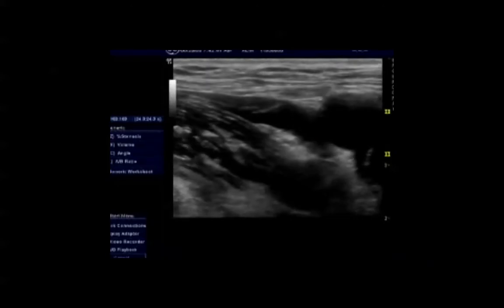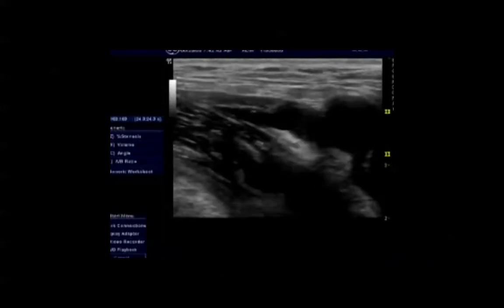But the important thing to note here is that at the end of our injection, here's our femoral nerve, which is still attached to the iliopsoas muscle. But our local anesthetic has passed in a tissue plane that is deep to the femoral vessels. So you can see the outlines of the fascia iliaca here illustrated by the green arrows. The local anesthetic has passed over the iliopsoas muscle, over the femoral nerve, or superficial to the femoral nerve, but deep to the femoral vessels.